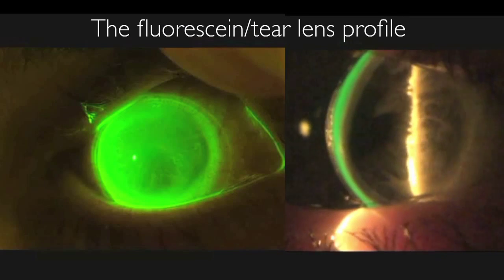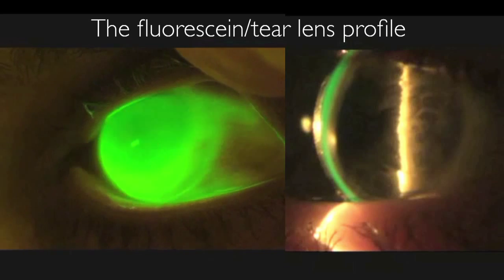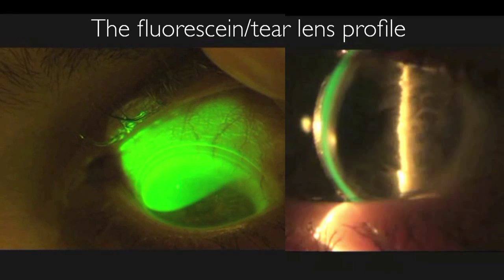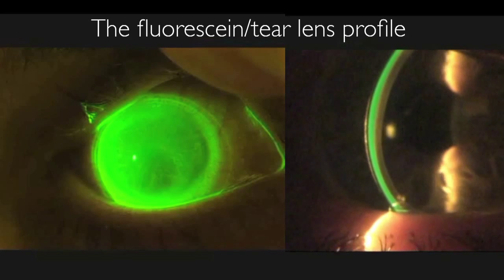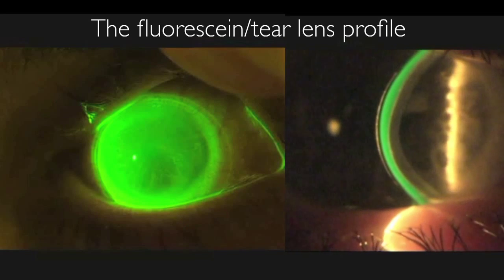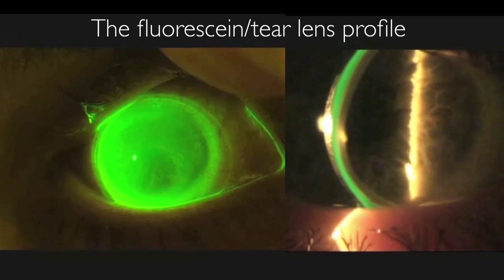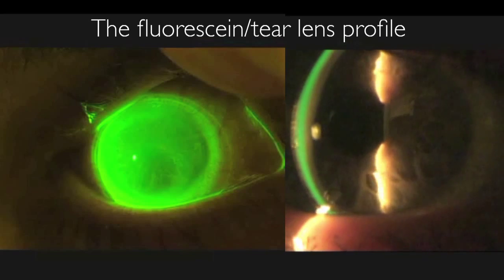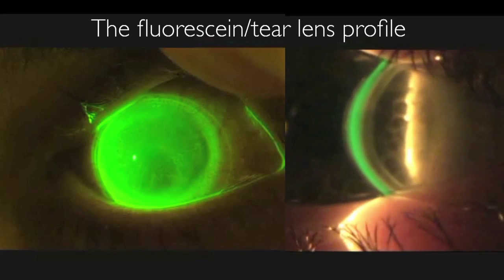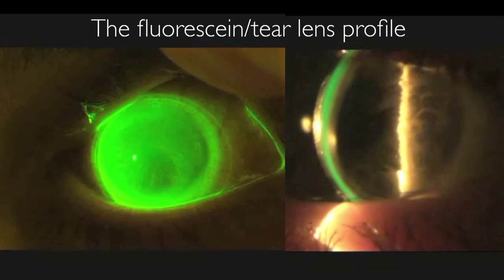Let's evaluate the fluorescein pattern. On the left we have our traditional fluorescein pattern using cobalt blue filter light from the slit lamp and the yellow enhancing filter in front of the objective to enhance evaluation of the fluorescein behind the lens. On the right I'm using white light with a thin optic section — I turn the light to its highest intensity and with the optic section I look at the height of the lens beyond the cornea, judging it by the fluid layer between the lens and the cornea. I find the optic section to be the more useful method.